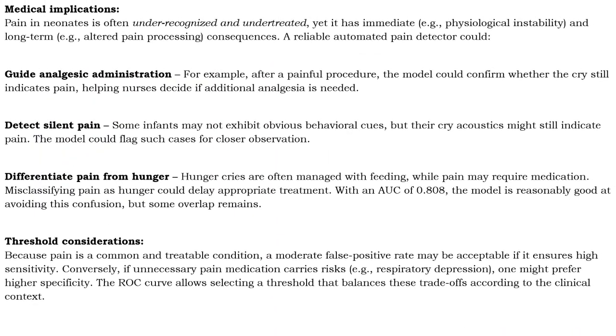Now, very quickly, let's look at medical implications. Pain in neonates is often under-recognized and undertreated, okay? Yet it causes physiological instability. Now, this could actually be a real guide to analgesic administration. For example, after a painful procedure, the model could confirm whether the cry still indicates pain, helping nurses decide if additional analgesia is needed.